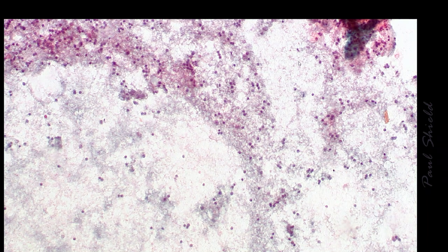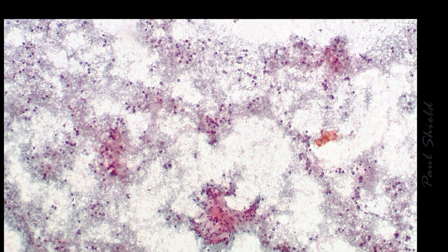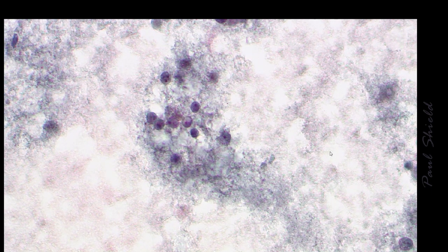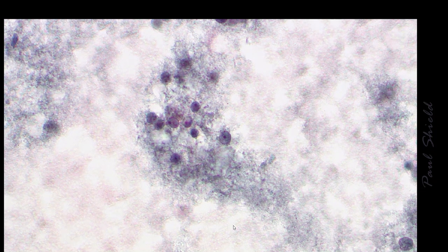This is a Pap stain. You can see it's kind of messy. Again, the background is full of proteinaceous material, so that gets precipitated out by the alcohol, and it looks like sort of granular material, a bit like cyst. And then these are the epithelial cells. You can see they're vacuolated. They have large nuclei, prominent nucleoli, very smooth nuclear membrane, and fairly uniform in size.